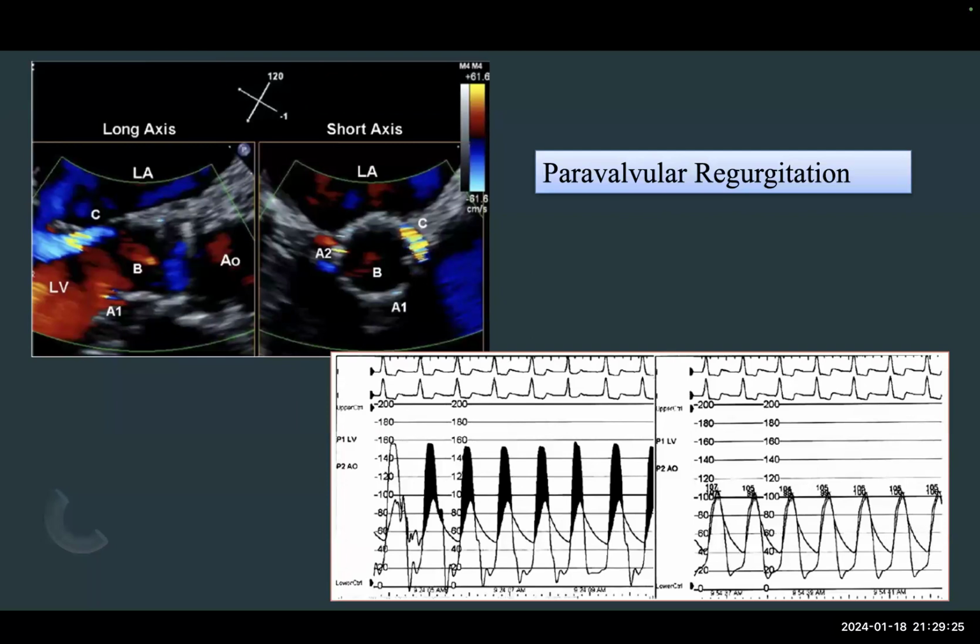That's why when we do CT scan, we assess the possibility of putting this cerebral protection device. So to answer the question in your exam, you would say it's not routine, because it did not show a benefit for all patients, but it reduced large disabling stroke.